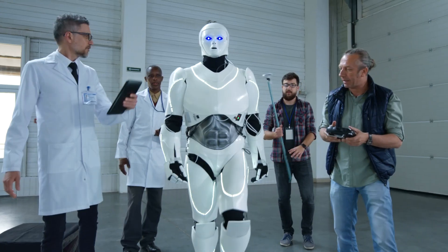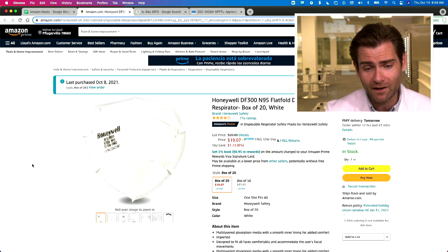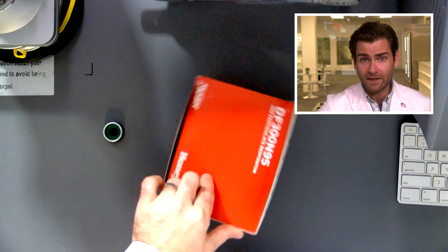Hey everyone, welcome back — we're testing every single mask and respirator on Amazon. Today we're looking at the Honeywell DF300. How do they come up with these names? It sounds like a robot from space, but it's a KN95/N95-style mask you can buy on Amazon for about a buck a piece. Pretty good. It's the KN95 style with head straps.